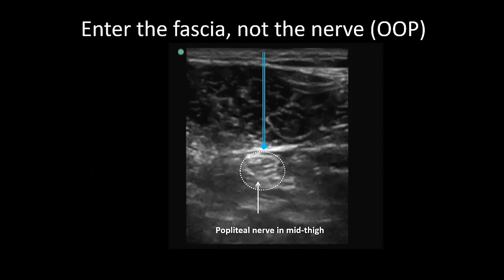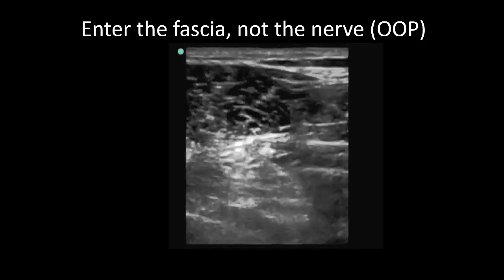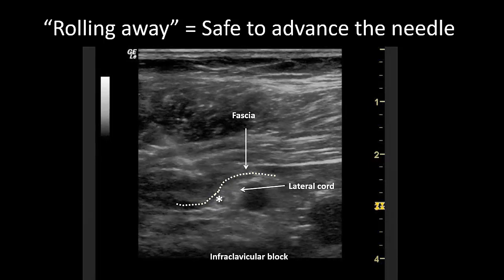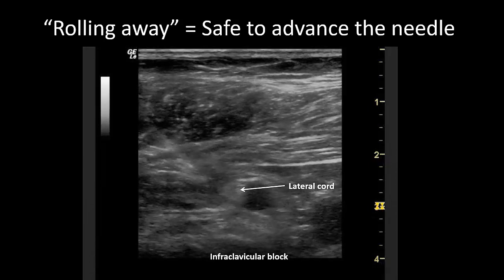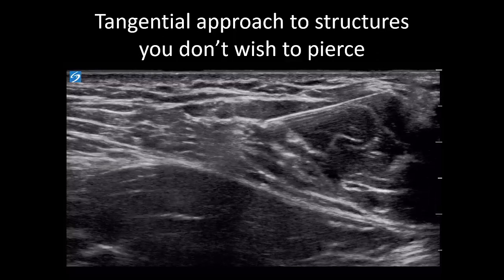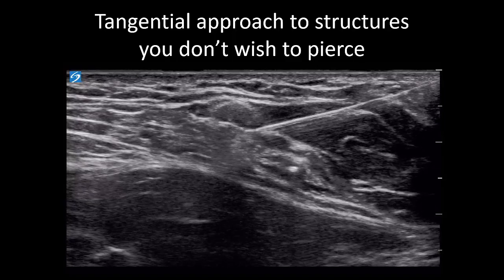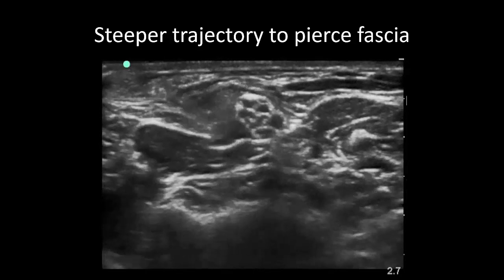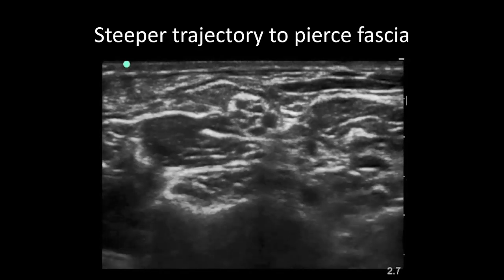This illustrates not advancing directly onto a nerve but at one side at a tangent to its circumference. The needle and the nerve should roll or slide to one side as the fascia is pierced. This rolling motion of the nerve is further illustrated here, signaling that the needle can be advanced with little risk to the nerve or in this case the lateral cord. Here we are passing between the median nerve and the axillary artery — neither are at risk of being transfixed because we are tangential to both structures. This video illustrates how, if the trajectory is too shallow, the needle glances off the fascia instead of piercing it. A steeper approach away from the superior trunk pierces the fascia and then the needle can be flattened to bring the tip close to the target.